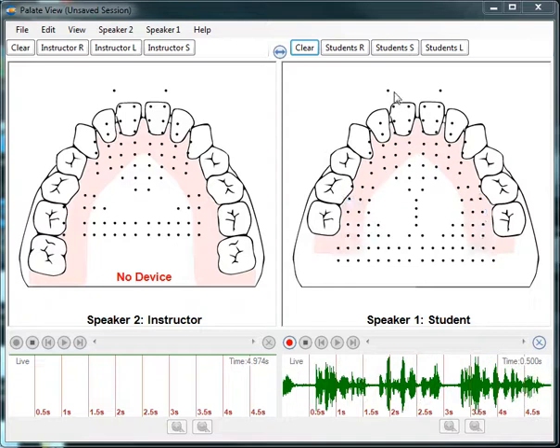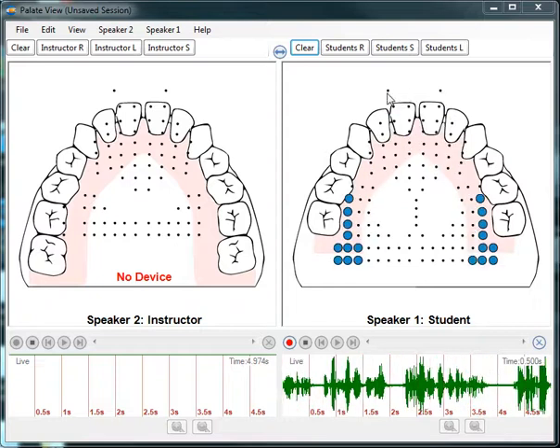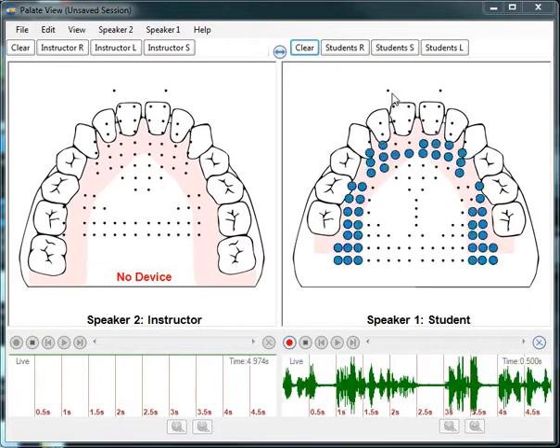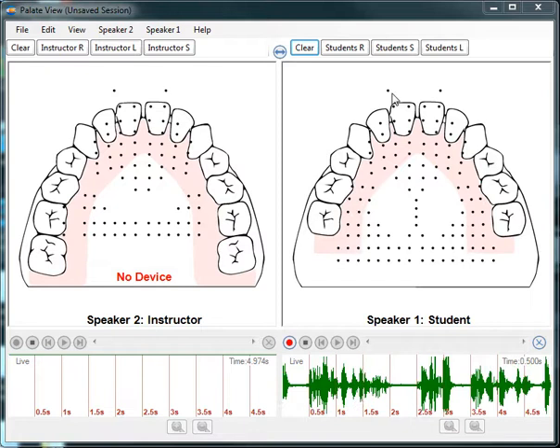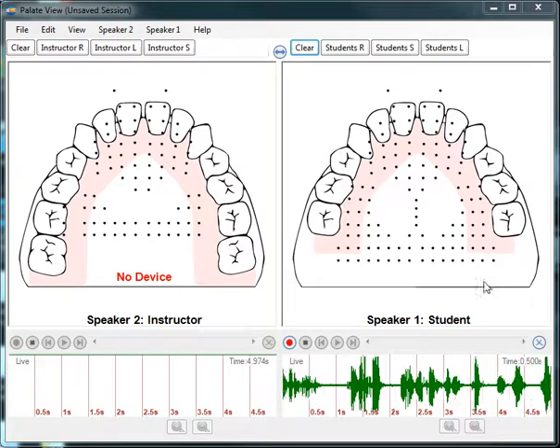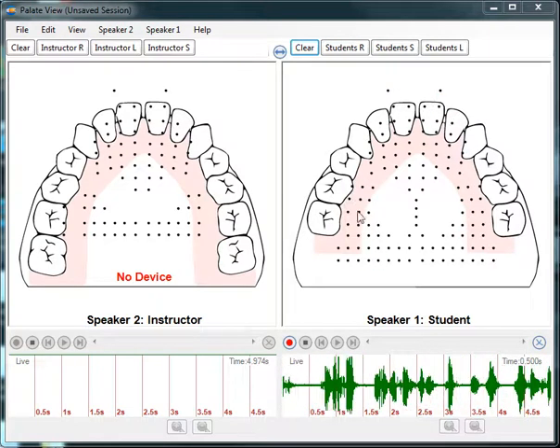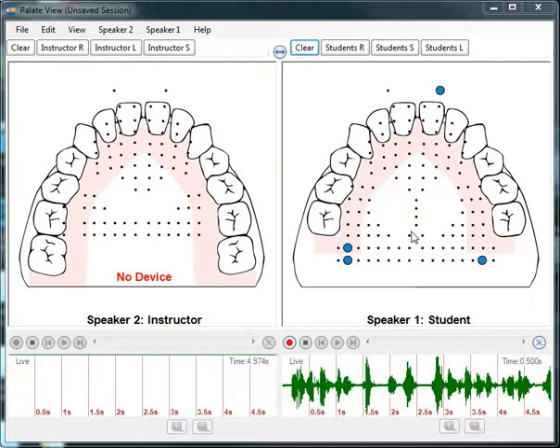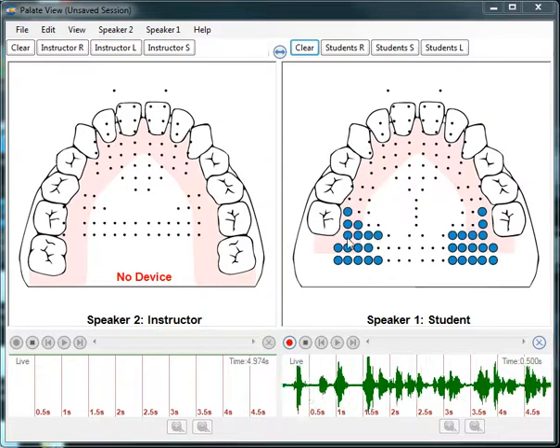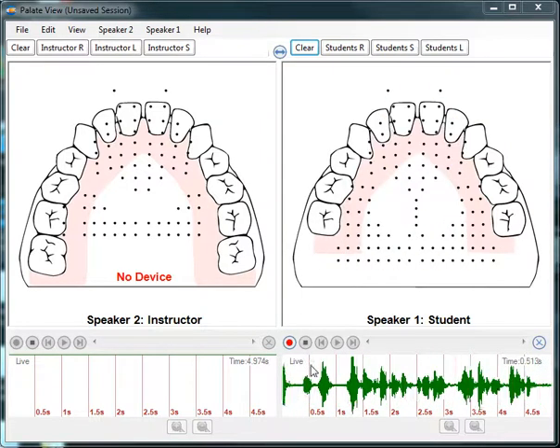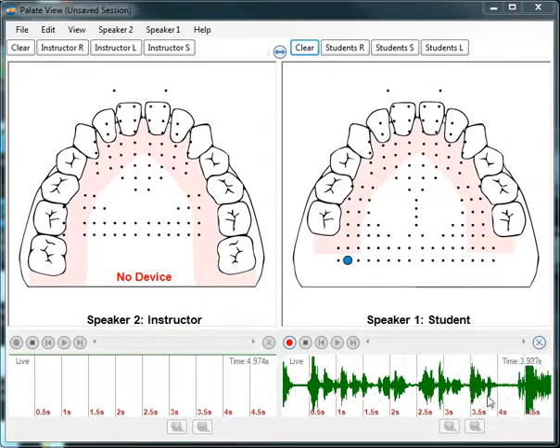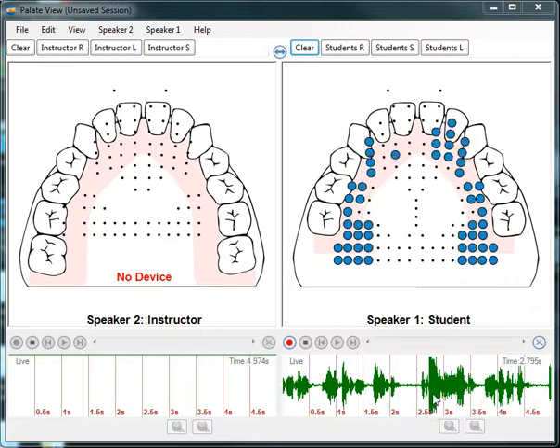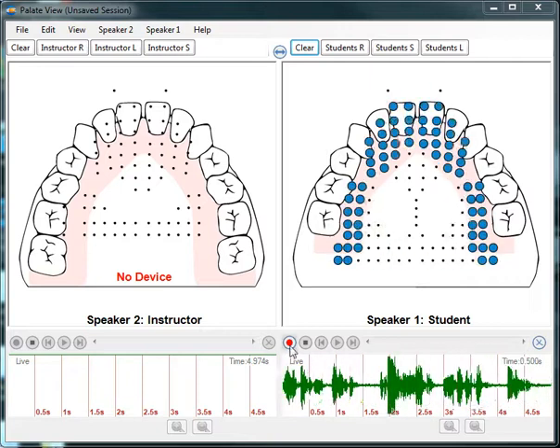These dots at the top indicate lip closure, like in 'pop' or 'mom.' The other tongue-to-palette contacts indicate where my placement is as I speak. At the bottom you see a waveform, and this shows you the pitch as I speak.